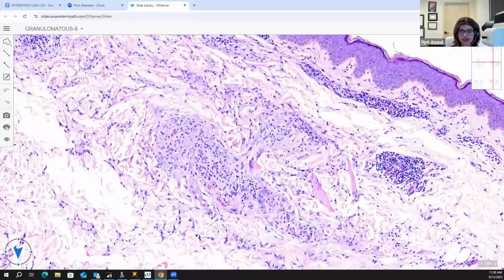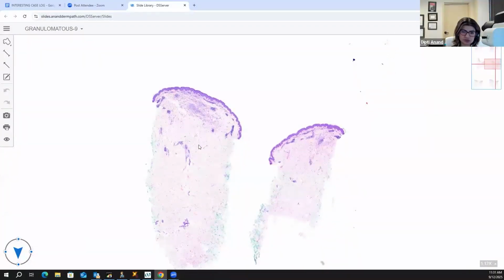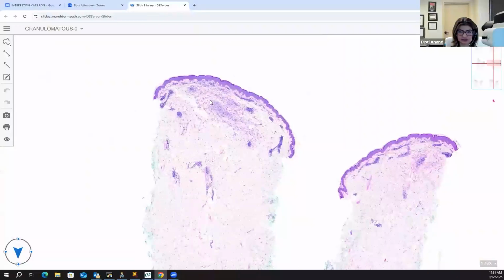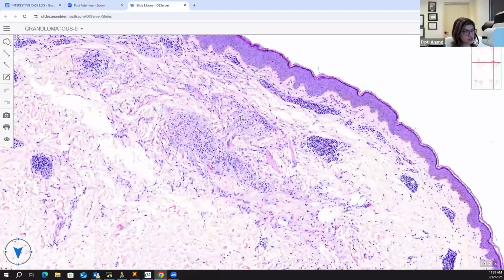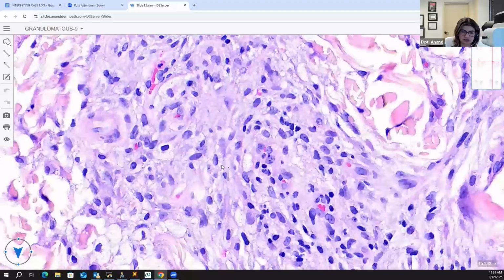Okay, so for a tuberculoid granuloma, this entire process is pretty much just located here, right? You see that? Typically, tuberculoid granulomas track down. And then when you go up on high power, you see there is a busyness here, right? So this is where I want to go on high power. You agree with that? This is where you would want to go up? When you go up in the high power, what are these cells?